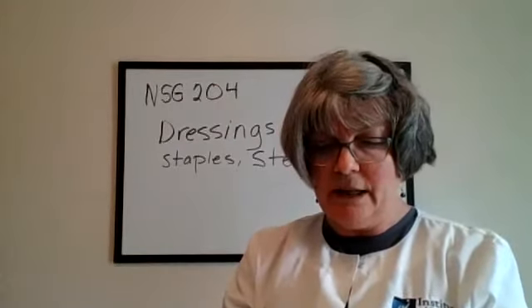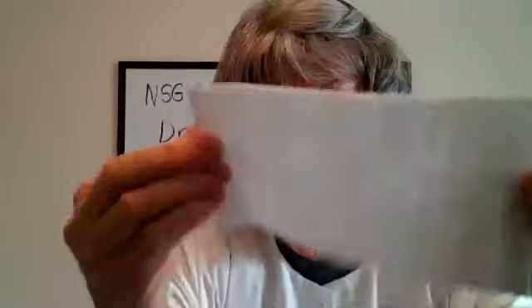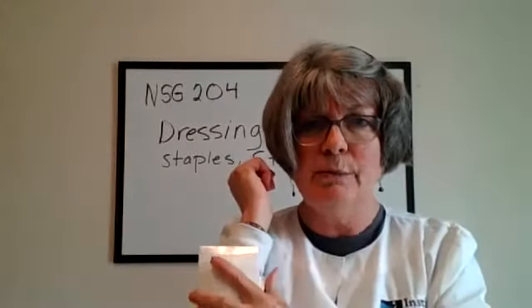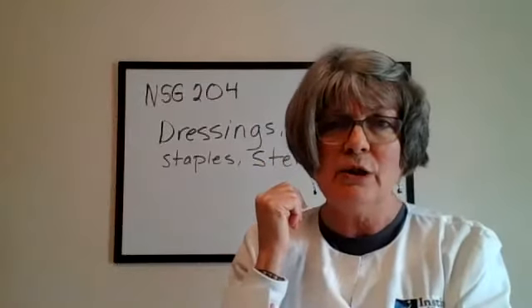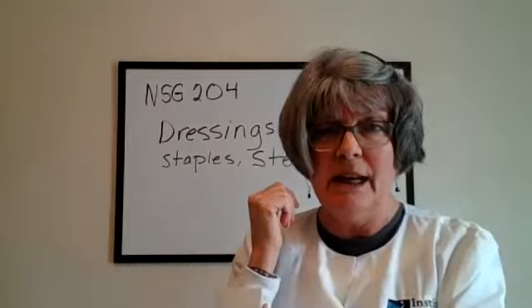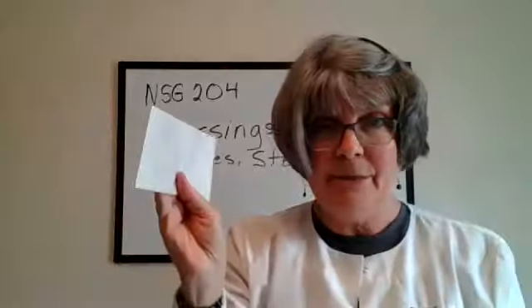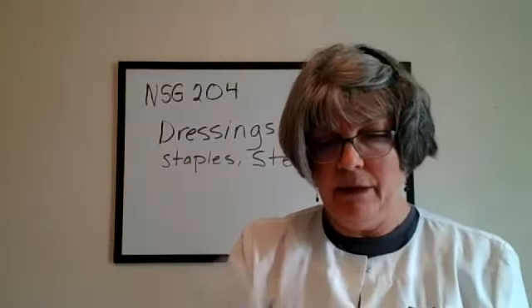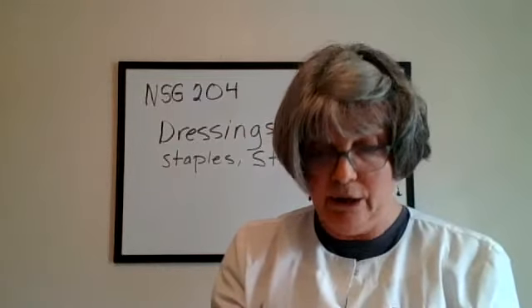It has kind of a plastic type covering on it, and it can go up against a wound bed, but it won't stick to the wound bed. It might stick a little bit, and you can use a little bit of sterile water or saline, and the dressing will just fall off. Telfa is a name that you'll hear oftentimes. It's just a non-adherent dressing.